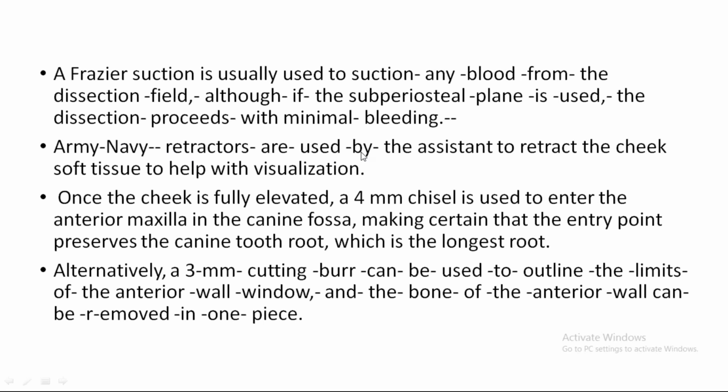Army Navy retractors are used by the assistant to retract the cheek and soft tissue to help with visualization. Once the cheek is fully elevated, a 4 mm chisel is used to enter the anterior maxilla in the canine fossa, making certain that the entry point preserves the canine tooth root, which is the longest one.